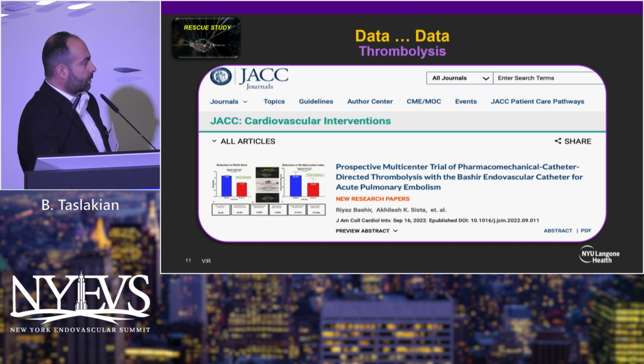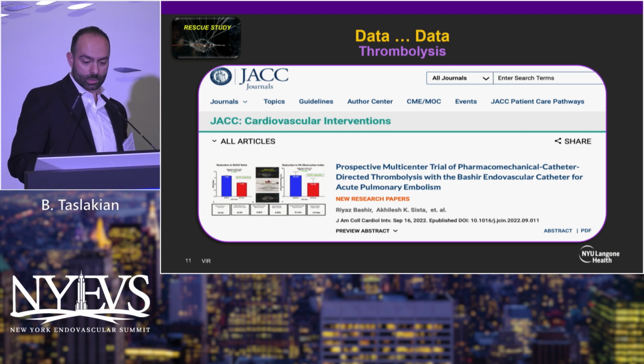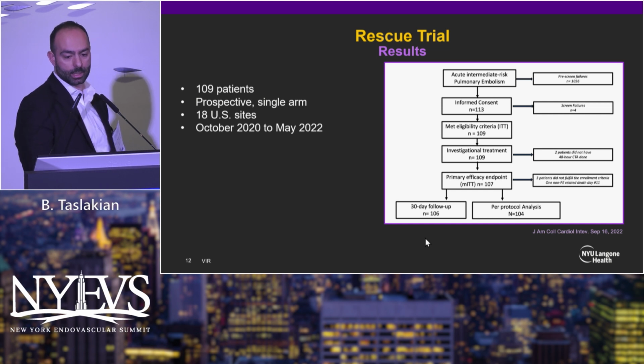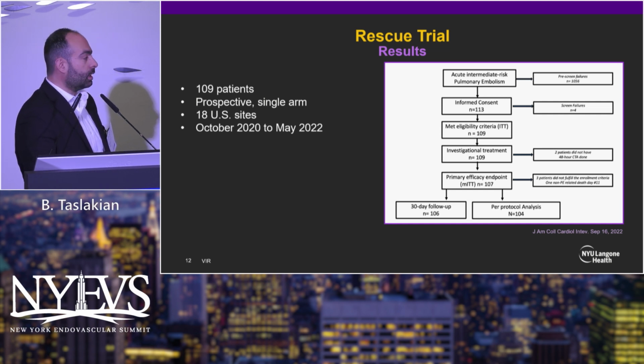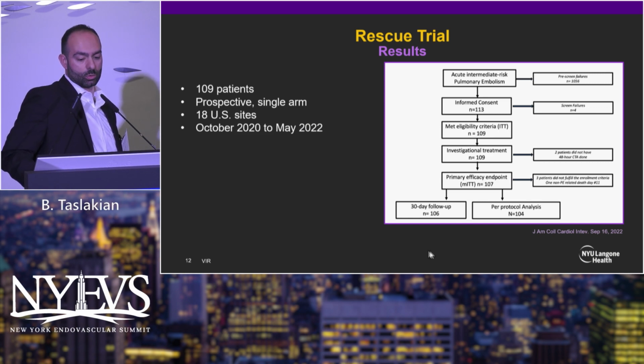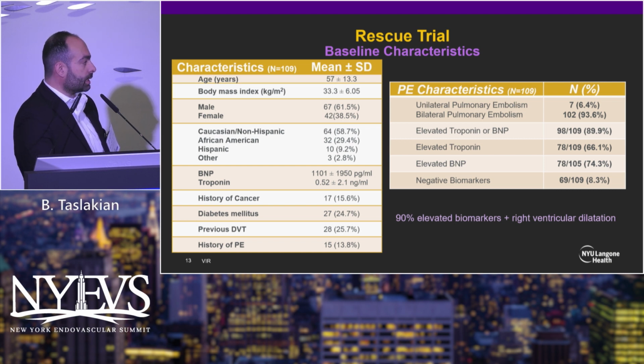Akil showed a lot of these results from the RESCUE trial, which was published recently. So I'm going to go quickly over it. Basically, it was a single-arm, again, prospective trial that enrolled 109 patients, 18 US sites, and the trial was from October 2020 to May 2022. These are the baseline characteristics.